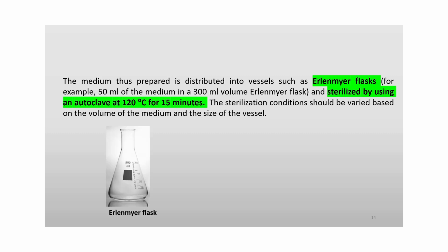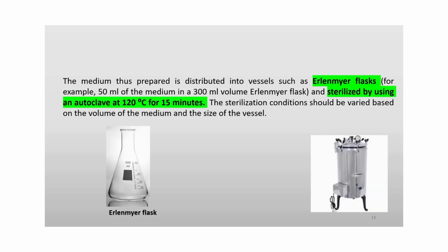This is an Erlenmeyer flask of 500 ml capacity which we have in our laboratory. Autoclaves of different sizes, room autoclaves, big shelf autoclaves are also available. We can use them according to the quantity which you are preparing.